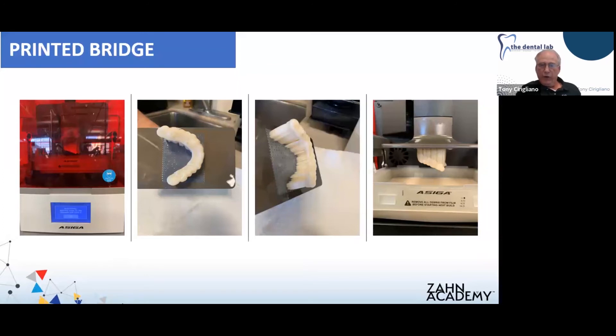Here are photos of the case coming out of the printer — on the build plate you can see all the connections made to the bridge. Yes, you need that many. They break off very easily, so don't be alarmed at the major mess to clean up — they snap off pretty cleanly.